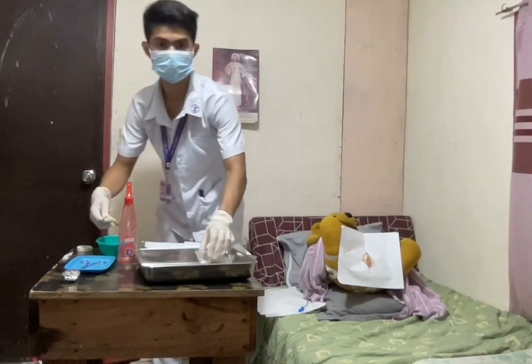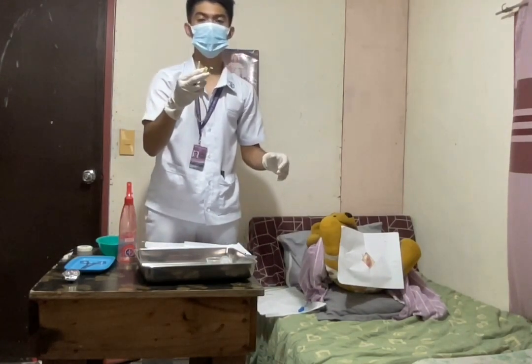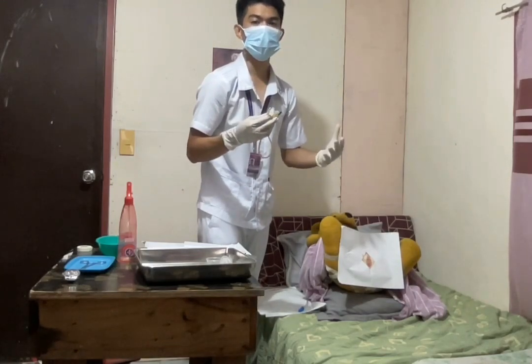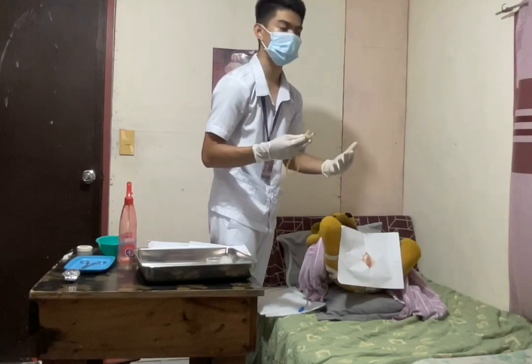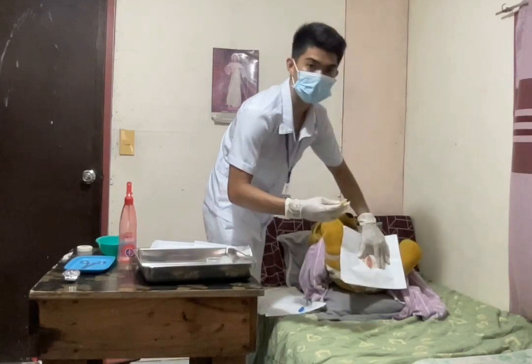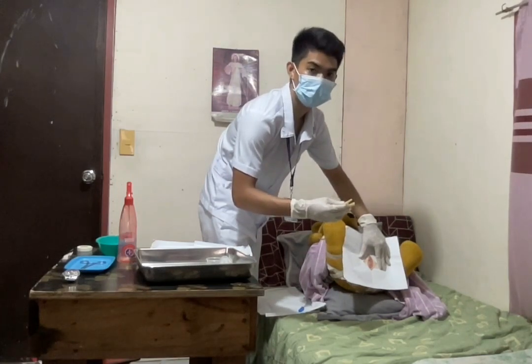Next, I'm going to pick up the catheter at least 3 inches from the tip with the thumb. Then place one finger on the left or right hand between the labia minora, separate and pull up gently. This properly positions the catheter for insertion while minimizing contamination risk. Just like this. Then insert the catheter into the meatus for about 2 to 3 inches or until urine begins to flow.